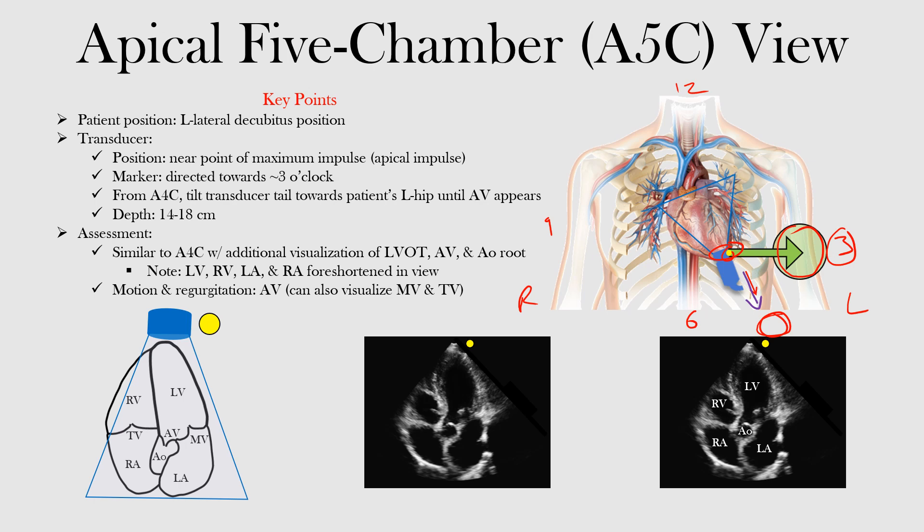The depth we can keep between 14 and 18 centimeters, similar to the apical four-chamber view. Obviously, that can change based on the patient.